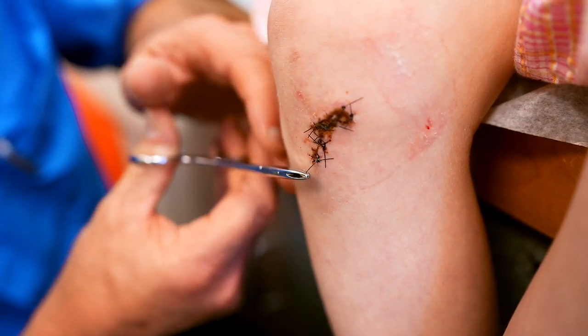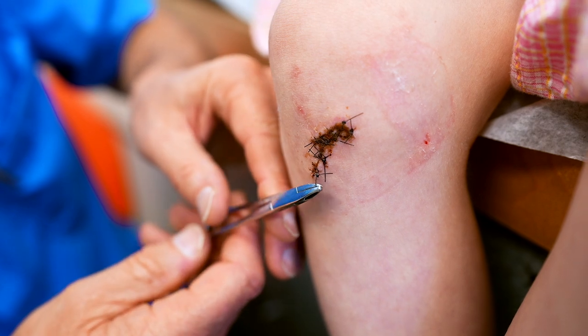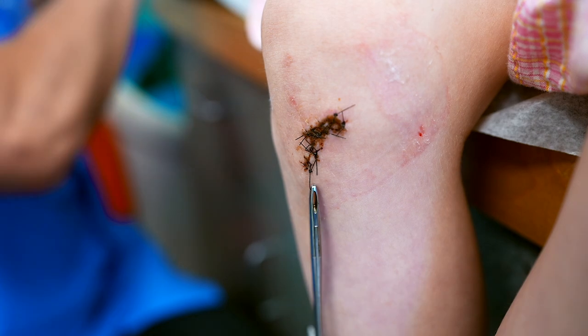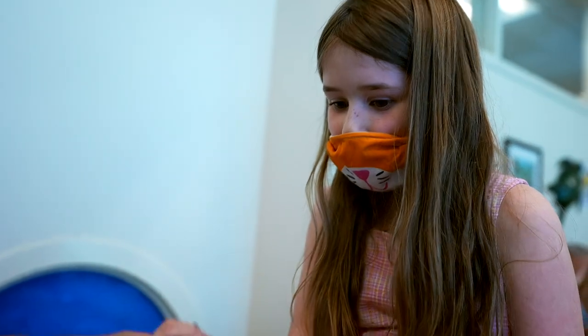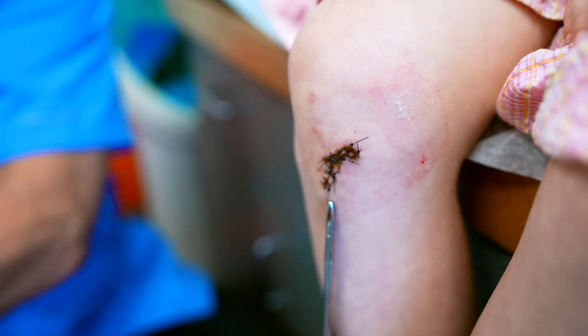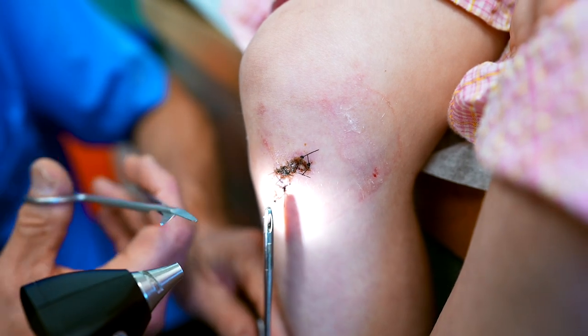See? That didn't hurt, did it? You okay? We'll get a little light. You still okay? It's like a tiny one. Actually, can you hold the light for me? You will? Alright, hold it right there. You got it? Perfect. You're a great light holder.